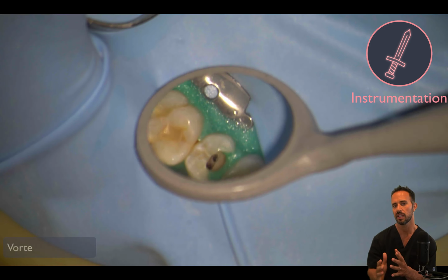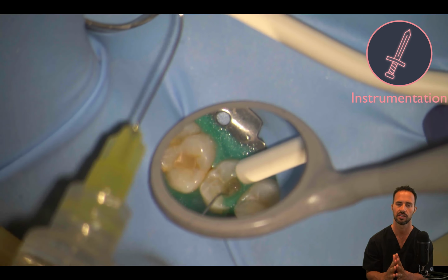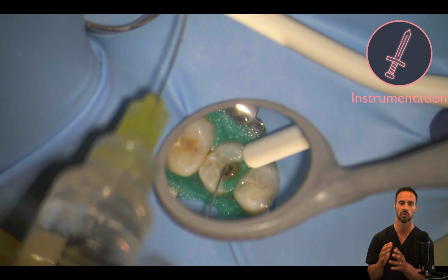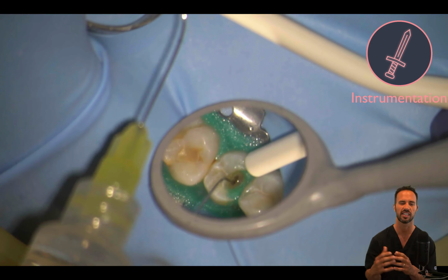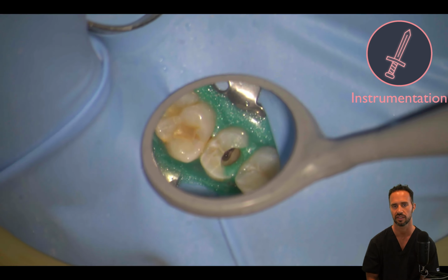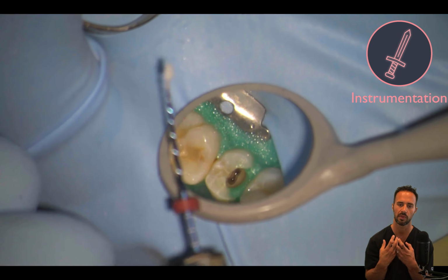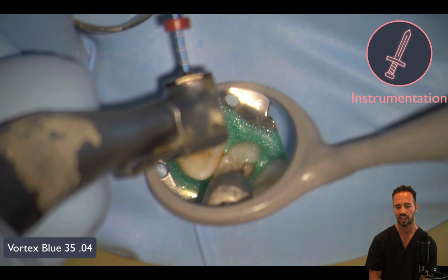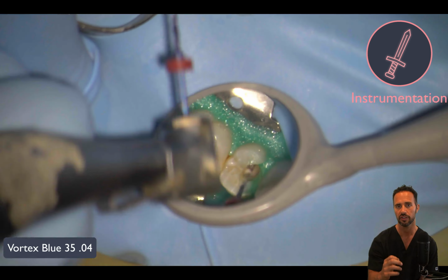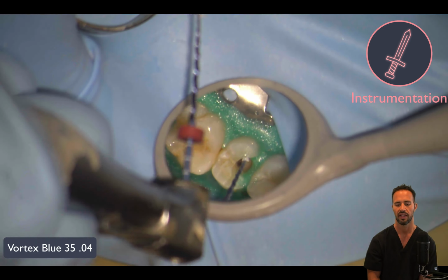Okay, generally speaking, especially for a vital case and for most canals, a size 35 is a great endpoint. That's not a hard and fast rule by any stretch, but that's generally the size that I typically end with in a lot of my canals that I'm instrumenting. So that's a size that's reasonable in terms of making sure that you're fully debriding. And now, like I mentioned, this is our size 35 Vortex Blue .04 taper rotary in the buccal, and then into the palatal.